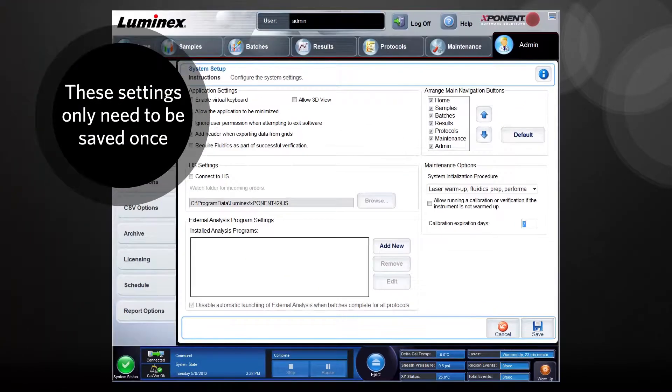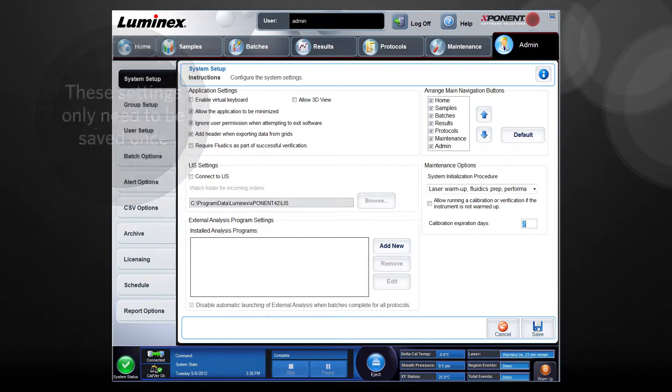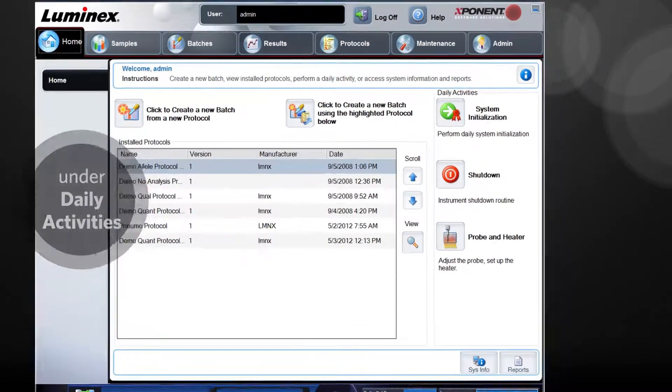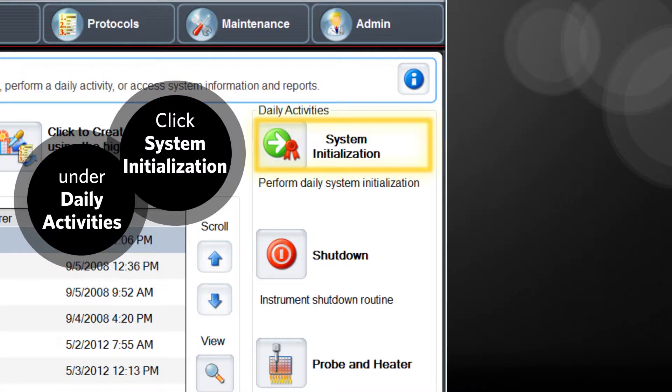Click save if any changes were made. Please note, once these settings are saved, you should not need to change them again. To run a daily system initialization, from the home page, under daily activities, click system initialization.